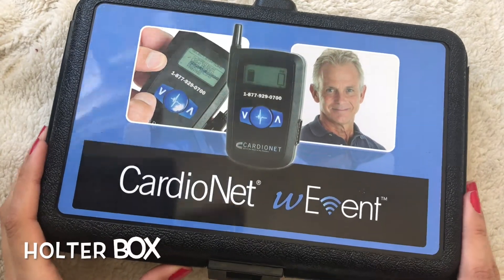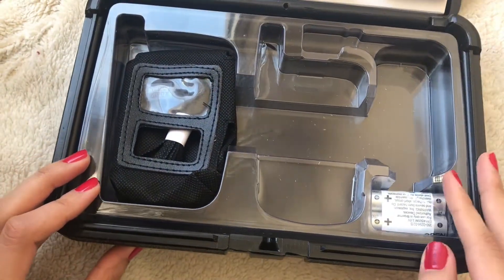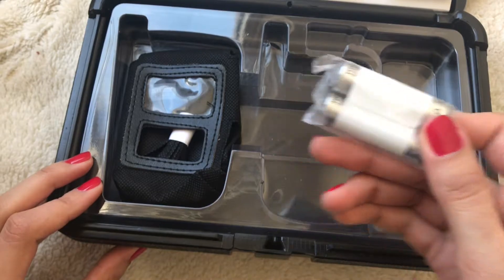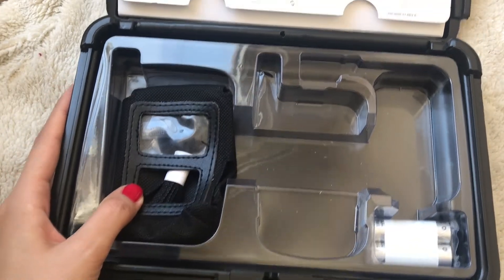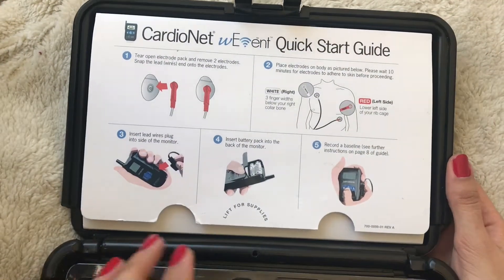This is a CardioNet box — this is where all the Holter monitor and everything came in. On this side is where the equipment was. They give you an extra set of batteries just in case the ones you have run out, and they give you a case with a lanyard. We didn't find the need to use it, but you can if you feel it's necessary. On the other side is a quick start guide.